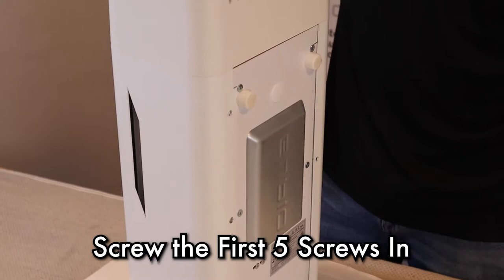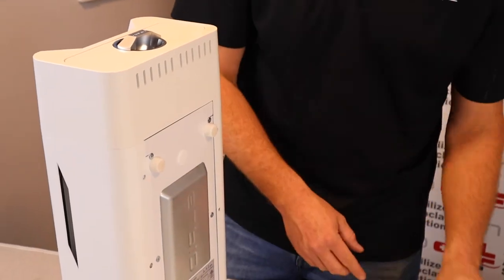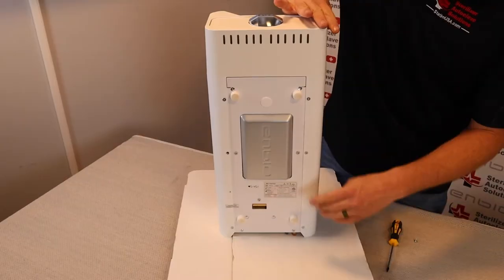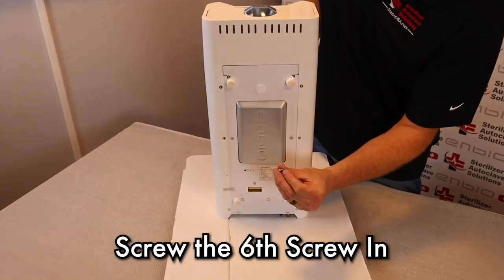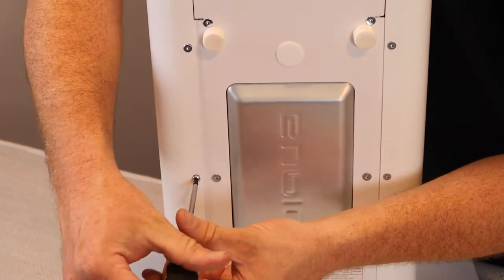Five of them are the same. The sixth one has a little bit of a bigger head and there are actually ribs on the bottom. Starting from the top, I'm going to work my way down. The five similar screws are installed. We're going to install the last screw that has the ribs on one of the sides using a T20 Torx.